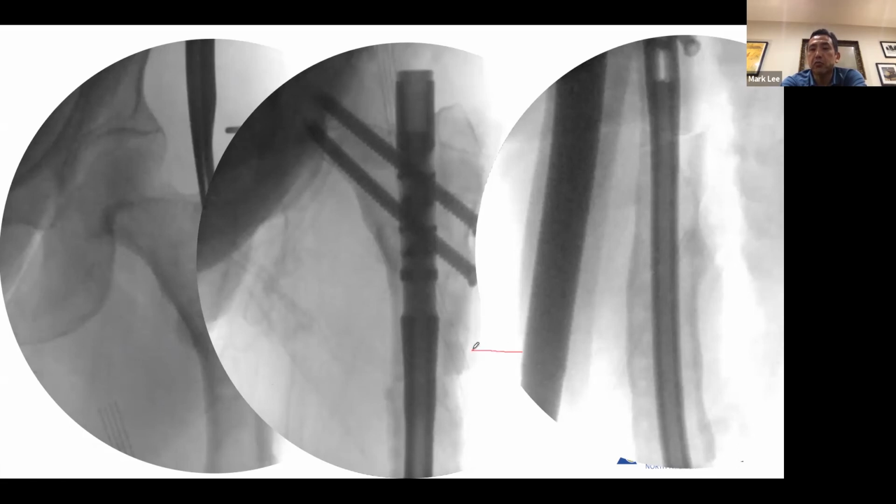It's a lot of extra work, but it could give you a little more space because you got a little asymmetry in your cortical diameters, your cortical thickness, that you might have been able to tilt that proximal segment a little more neutral. I'm not criticizing. Very nice correction. I don't like to criticize, but I think you could have got a little more neutral position on that top fragment.